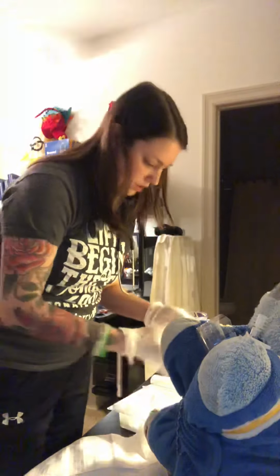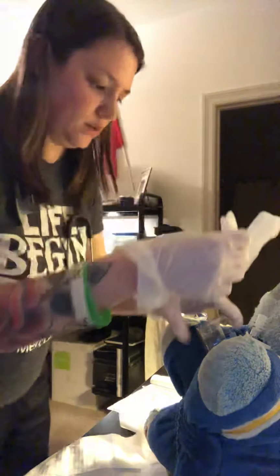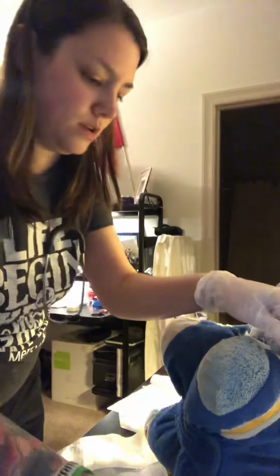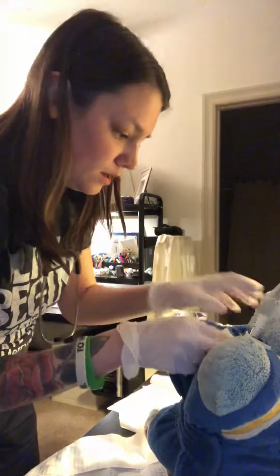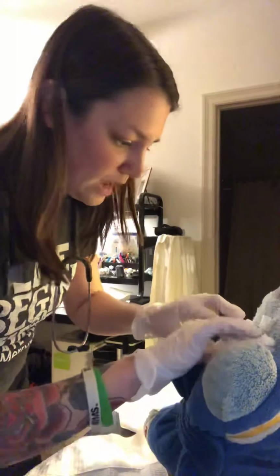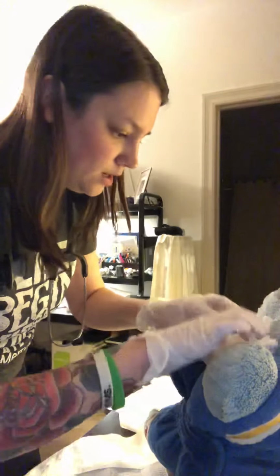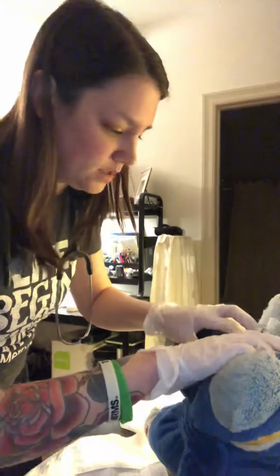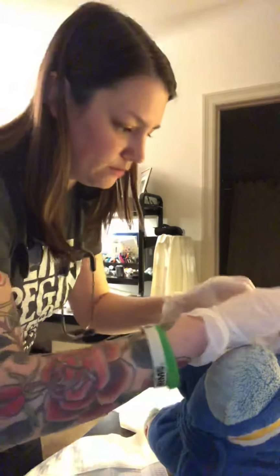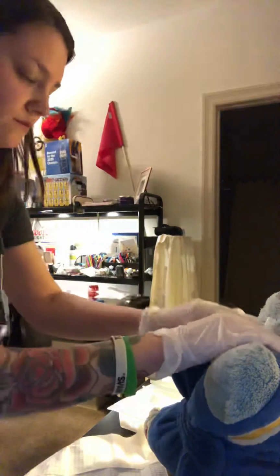Okay, so now I will put the dressing on there. Move this out of the way. Put it under there. My tape isn't really working very well, so this would actually be underneath that little part there, the face of it. Make sure it's all secured in there. Make sure it's up there. Okay, all good in there now.